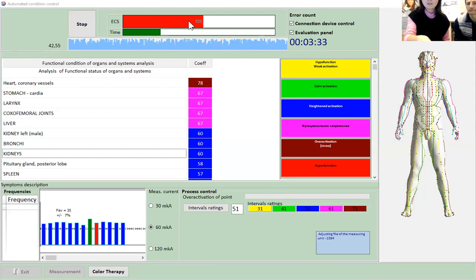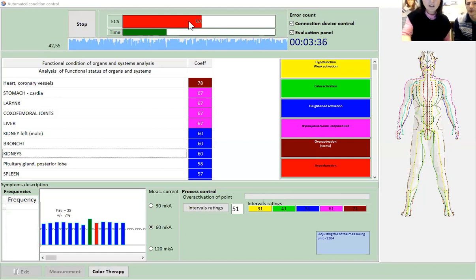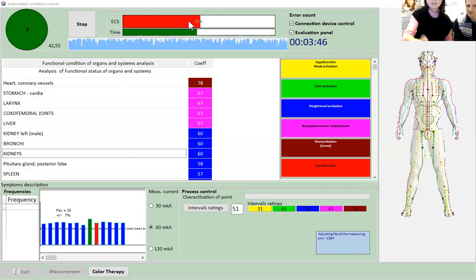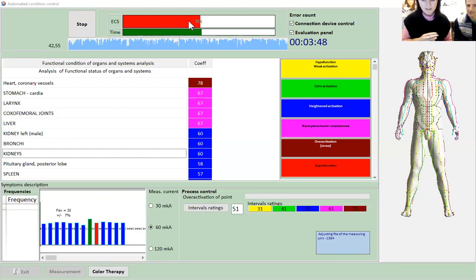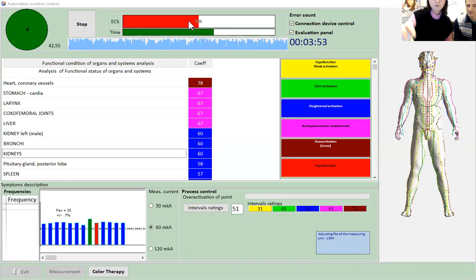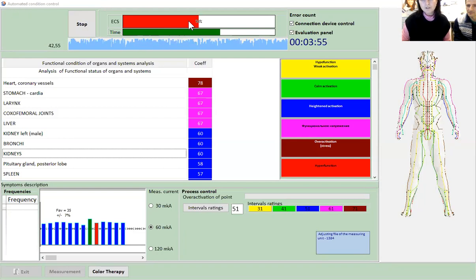Now you see it doing a measurement again. This coefficient is the measurement. This is the first measurement, then it will do the second measurement. Over these 10 minutes, it will measure him every time and put all these numbers together so we can go through them after.